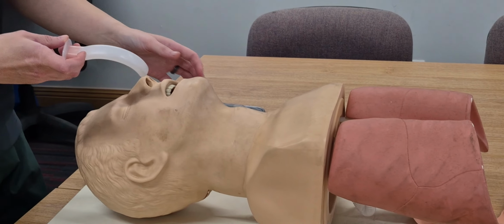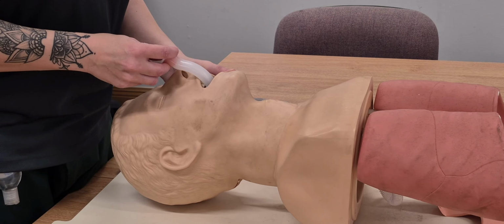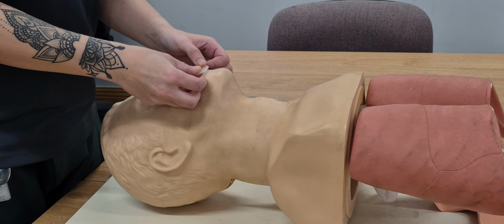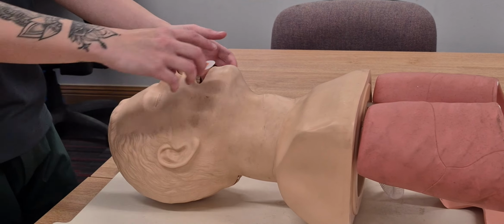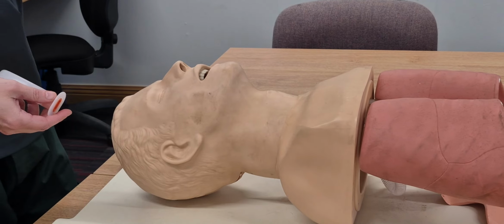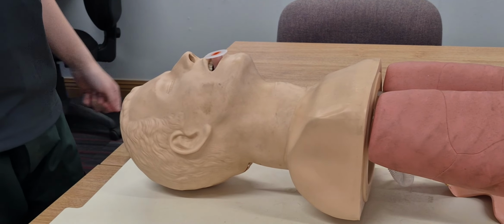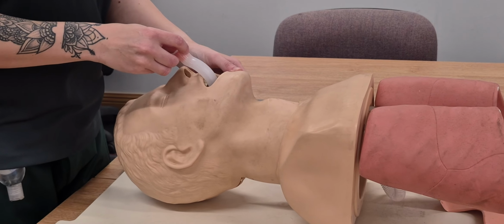And then all we have to do is invert it, so we're going upside down: invert, insert, and then halfway I'm going to rotate, so I'll sweep the tongue out of the way, and place. As easy as that. We can insert them anatomically as well, so just pull it out like that. If you have the use of a tongue depressor, you can put them in this way, but it's just a little bit more difficult, so that is why we put them in like this, upside down.